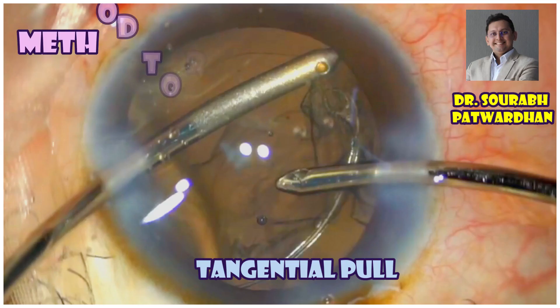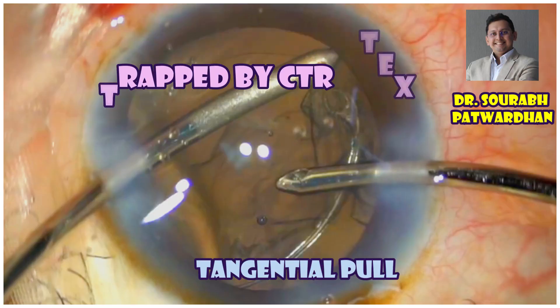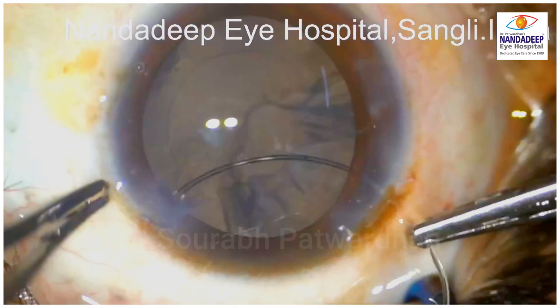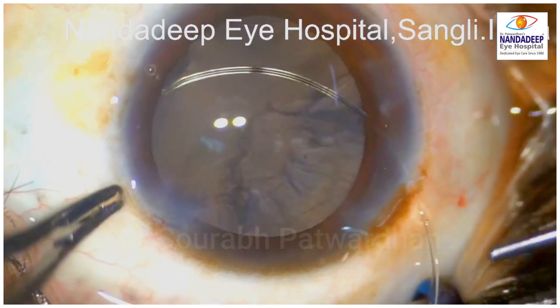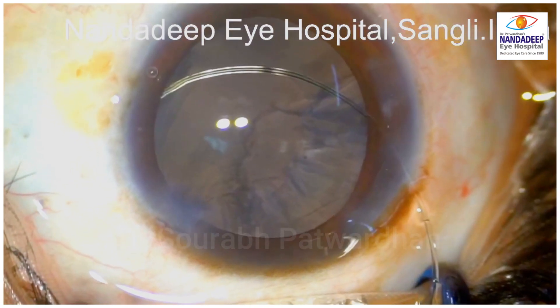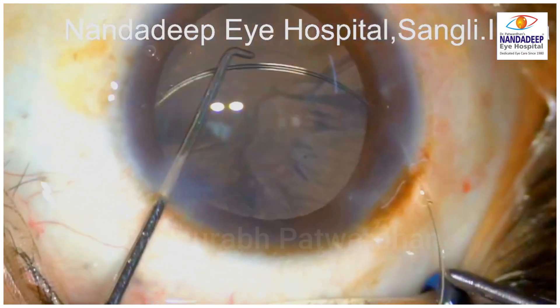In this video, I will be showing the method to remove the cortex trapped by the capsular tension ring or CTR and how to apply the tangential pull. This is a case of high myopia. The surgeon noted intraoperative dialysis or zonular weakness and decided to put a capsular tension ring.